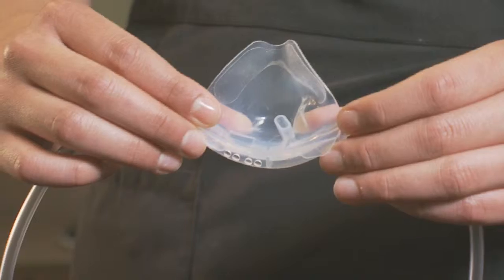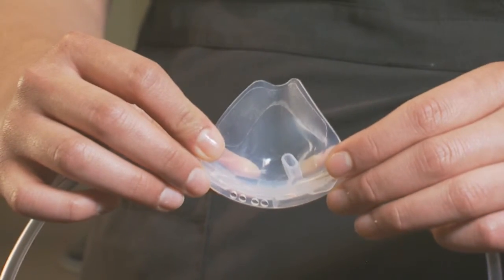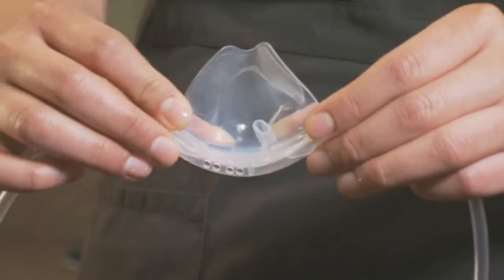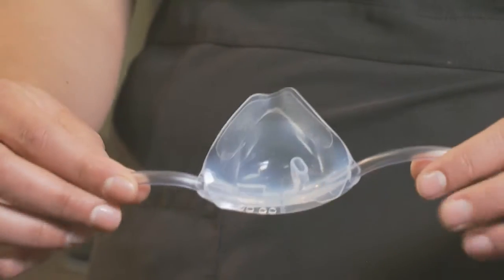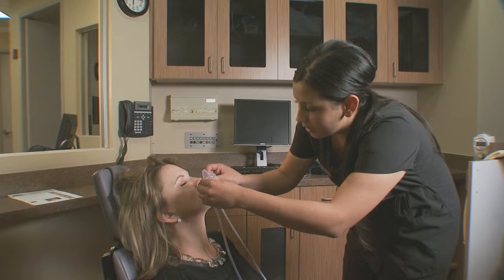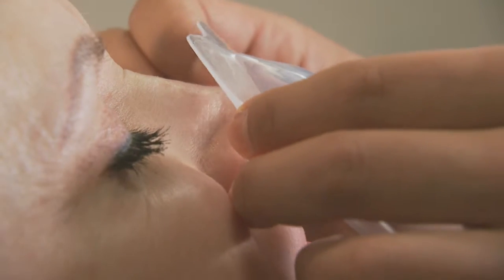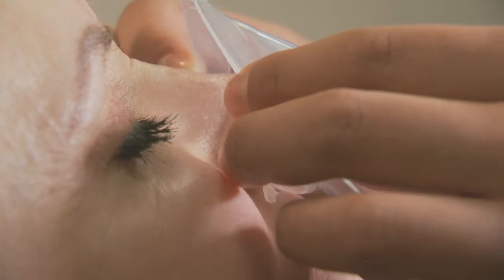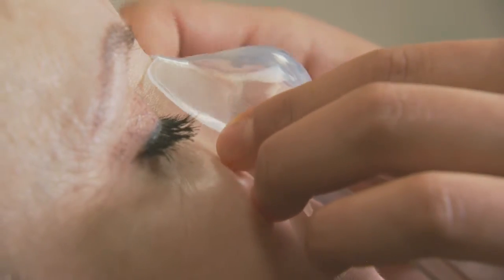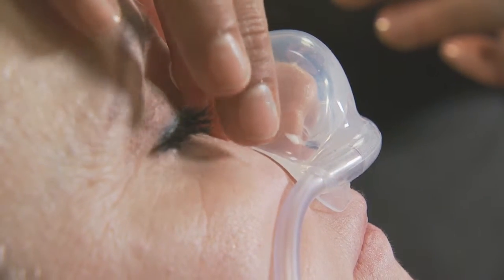There is going to be a prong on the right nostril that will slide into the nostril. When placing it, the easiest way is to flex the mask to make sure the prong is going into the right nostril. As you place it, guide the nostril while watching that it's placed into that right side. Once that is in, rotate the mask up and pinch right at the bridge of the nose lightly to make sure the adhesive seals.